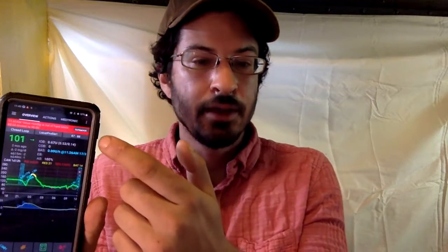With the targets, I tried to set 87 to 88, and I get this error that says value max blood glucose is out of hard limits, 88 is limited to 90. So I have to go back to my local profile, which in your first week of using this app is where you'll spend your time to fine-tune your basal, your insulin to carb ratio, your ISF. And so I had to go back and set that 87 to 90. It won't let you go less than 90, and I don't think it'll let you go less than 80.